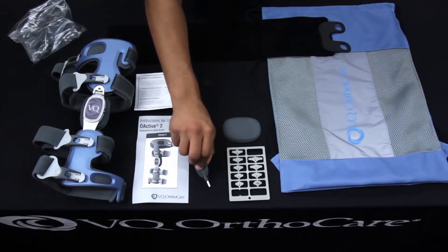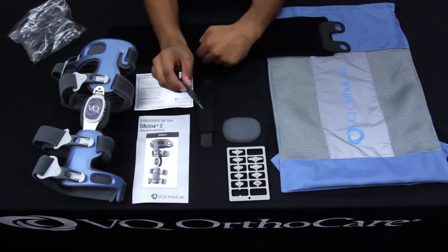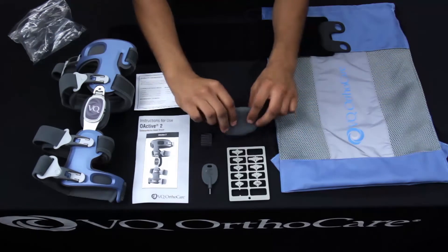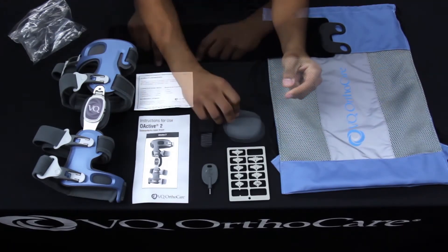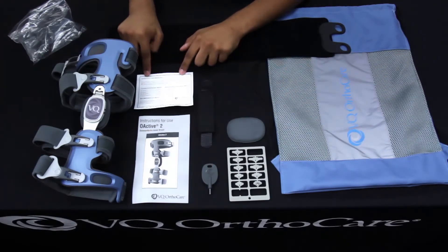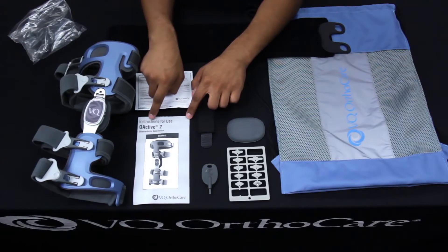The patient adjustment tool is used in the Q hinge to provide correction in the brace. The condyle pad is a thinner one than the one in the brace and may be used for comfort if needed. The warranty card tells you who to call for service of the brace, and the instructions for use will be covered in this video.